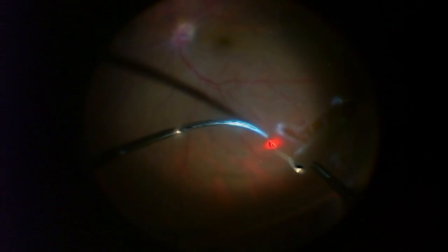And once I do this, I can laser around the tear. Now the video is a little funny here because we forgot to turn off the filter, but you get the idea. We're going to go around and essentially spot weld the entire tear. In the next couple of days, it should be impossible for the retina to re-detach through this single tear. The area that gets treated — good laser burns — turn white, so I'm going completely around the tear.